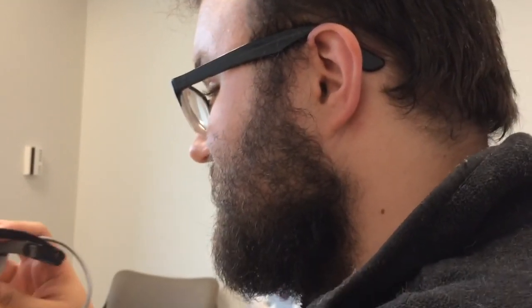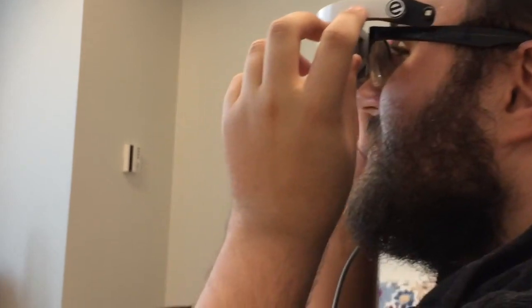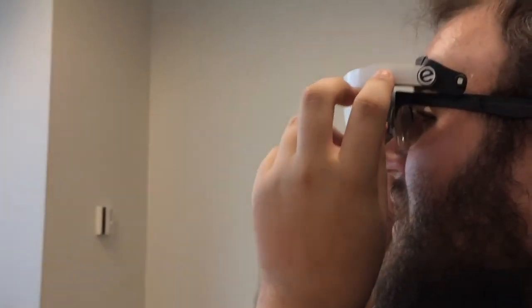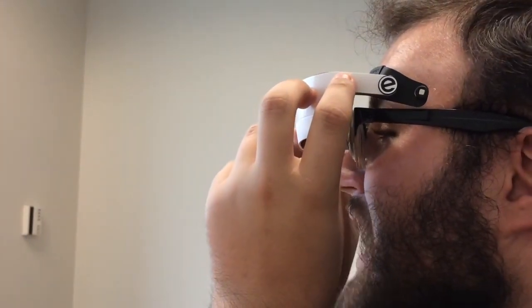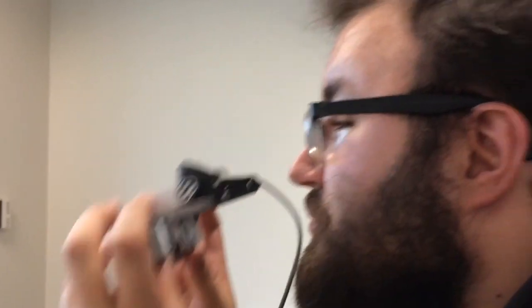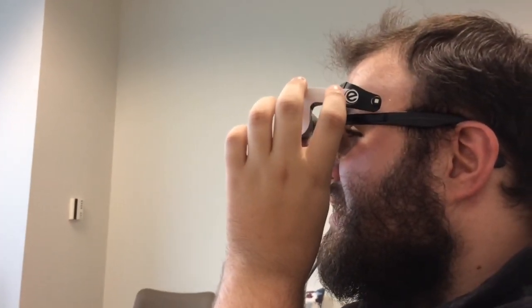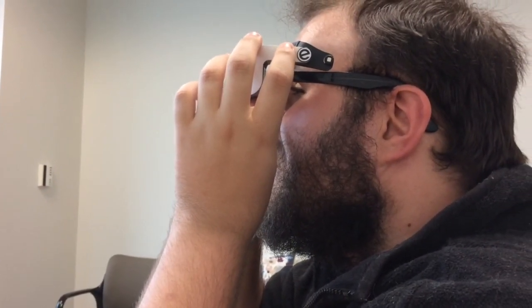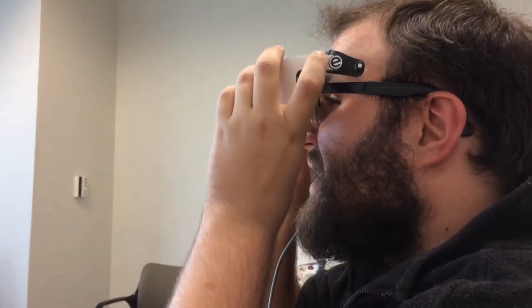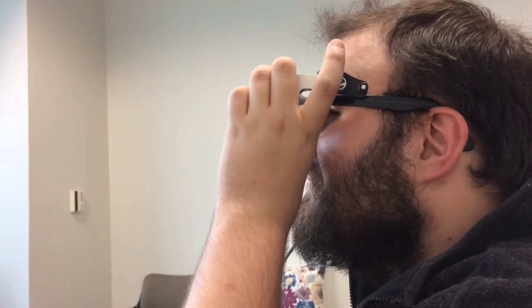The demonstrator asks the user to hold the glasses directly over his own glasses and lift his head slightly, then asks if he can see her face. The user says it's blurry. The demonstrator asks if his vision is normally blurry, and the user confirms his current prescription gives him less than 20 over 1600 vision. The demonstrator acknowledges that's outside their criteria — their sweet spot is normally between 20/60 and 20/500, with 20/600 pushing it — so the blurry image is likely due to acuity.